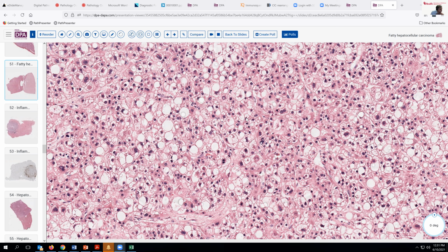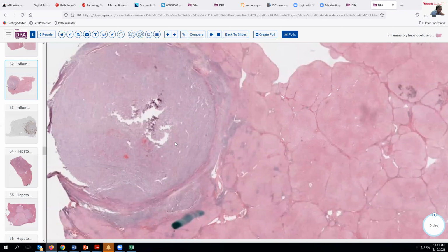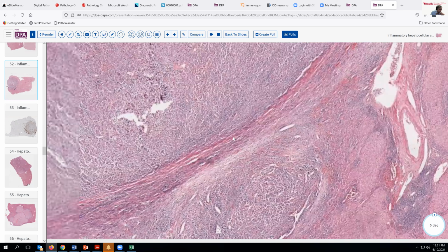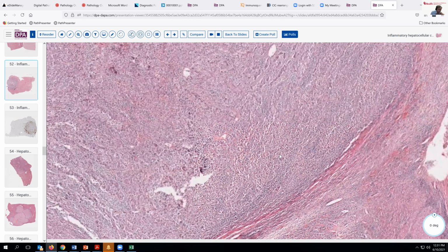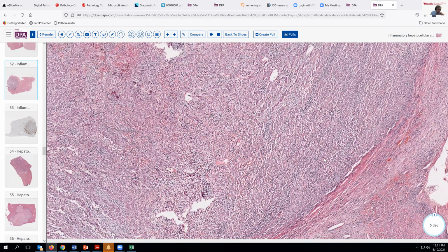Okay, well, I'm glad you're still awake, and we will go on here and talk about one of the variants that is also included there, a so-called inflammatory variant. And here you see a little bit of that. This is a lesion not perhaps unlike what we see in things like EBV-associated gastric carcinomas and so forth.